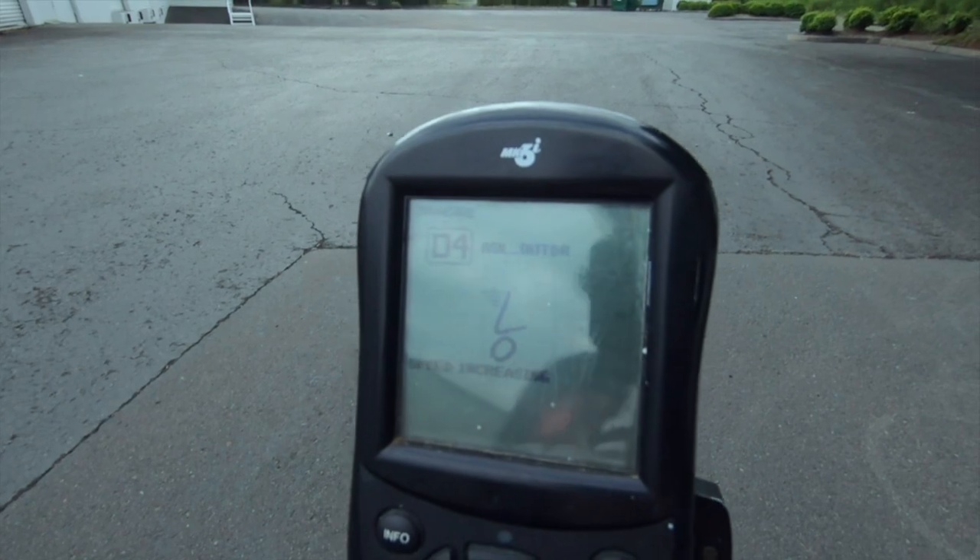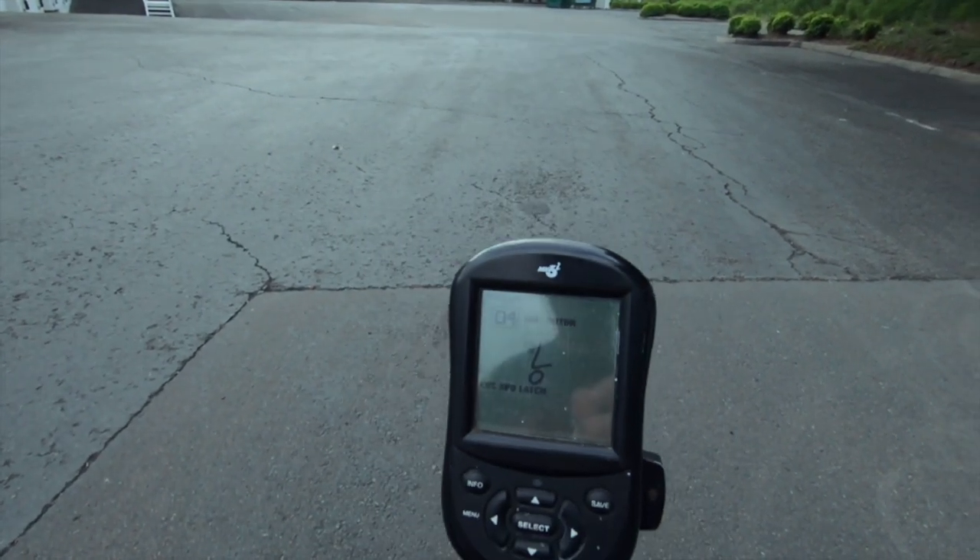I guess I left the profile stock on this one, which means it's only going to go — I think it's set to 20% speed. The steering is somewhat proportional. If I have my head touching the back and then lean to the right, it turns slowly. If I lean forward, it turns even sharper. This is actually really cool. Because I was wondering, like, for hiking on trails and stuff, what you do — because trying to hold your head back and bouncing around and all that is really obnoxious. This is neat. So I'm going to go back, hop on the computer, and adjust this profile up a little bit more. I should be able to set the speed to 100%, I believe. The way I think it's working is when you let off, it'll stop at the speed you're trying. So forward — I'm going to let go. Yeah, the second I let go, it stops at that speed. So if we want to go really slow... and then when I lean back, it increases again up to the max.